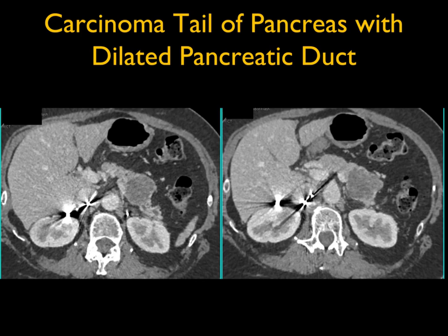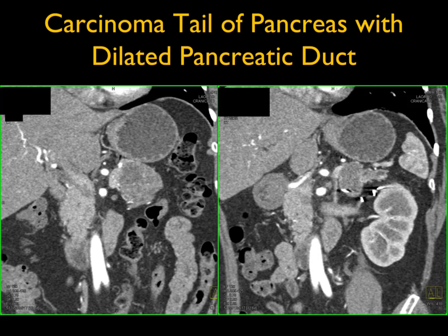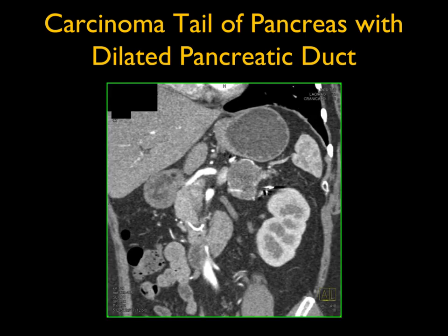This is a reminder that cystic pancreatic tumors do indeed occur. We always think about serous, mucinous, SPEN, and IPMN, but you've got to be thinking: don't miss a cystic neuroendocrine tumor — typically rim-enhancing — or a cystic adenocarcinoma, which was the case here. That duct dilatation and glandular atrophy really help with the diagnosis.